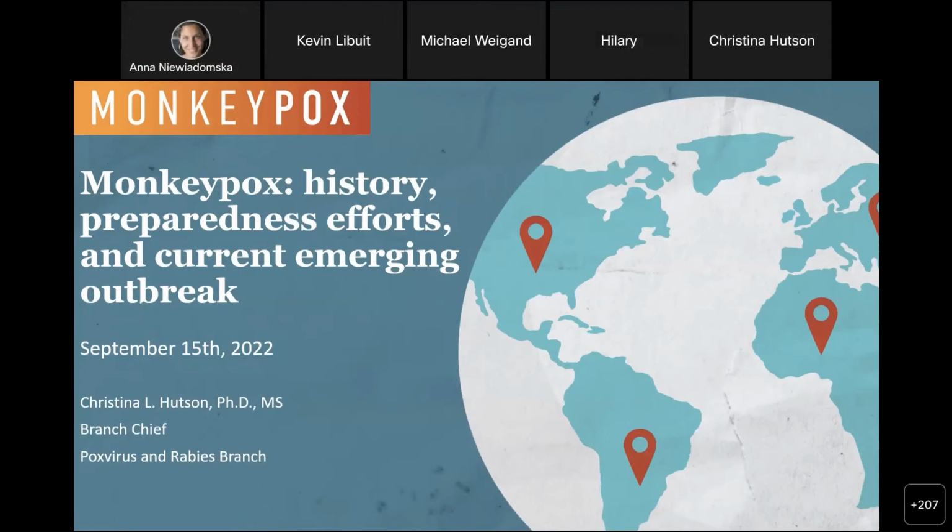There was an actual news release where Cepheid and BioGX are working to make this commercially available. This is the same test that we designed. They've changed it a little bit, so they are sending us cartridges to work with in our lab just to make sure the test still performs well.